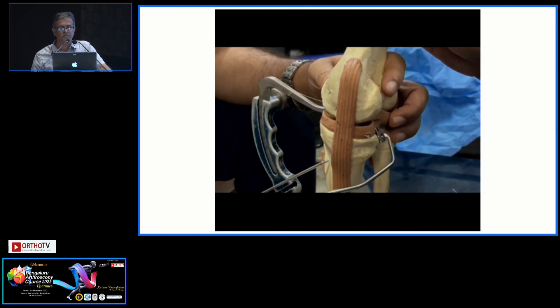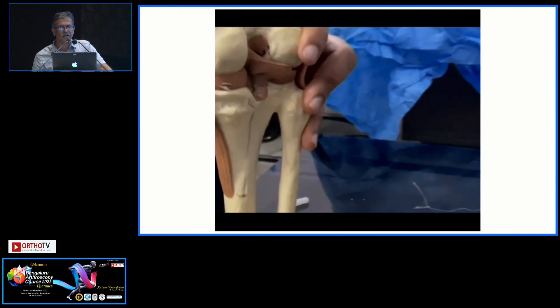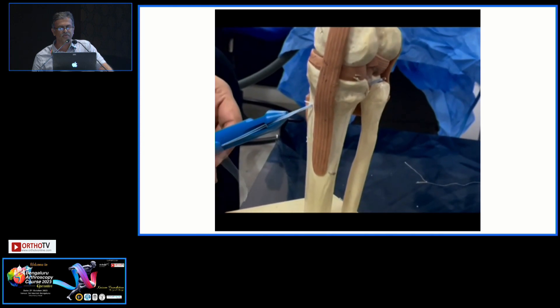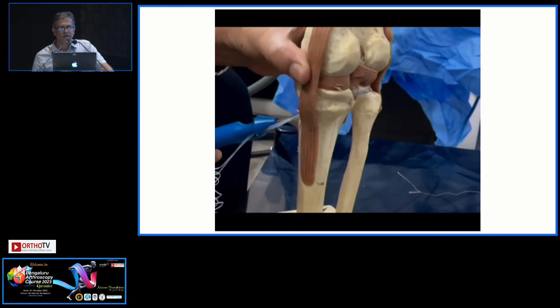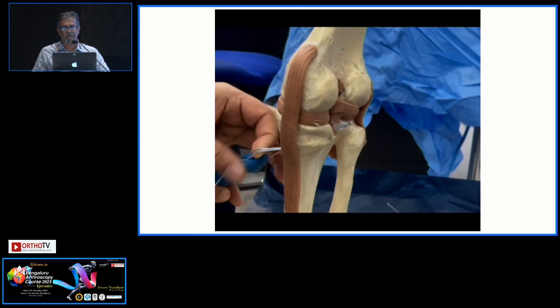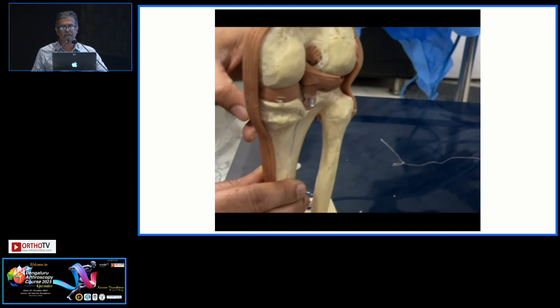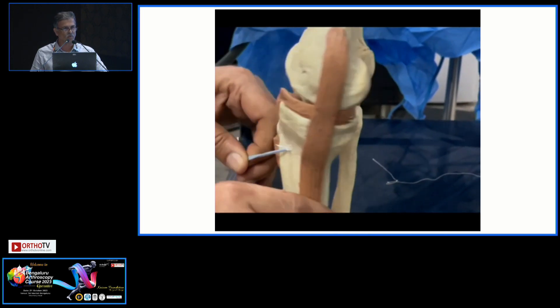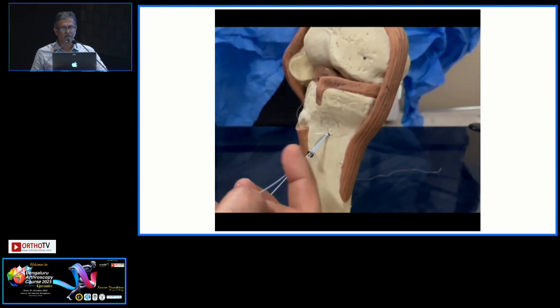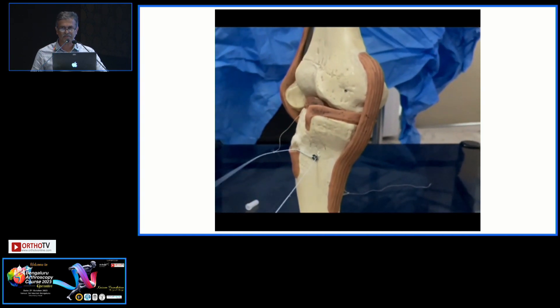You protect the posterior guide wire with some kind of protector. This is the tightrope mini — a single tibial tunnel. You put the button, which is closed on both sides, and remove the thread from the introducer. You perform a to-and-from motion to make sure the button is completely outside, then take out the button mounted on the plastic handle, and suddenly the button deploys. You can observe that the button sits exactly on the fragment. During this phase, make sure the fragment does not move, then start tightening — the same principle as standard tightrope — until the button sits and creates a nice closed loop with good compression. You can put some knots on that.